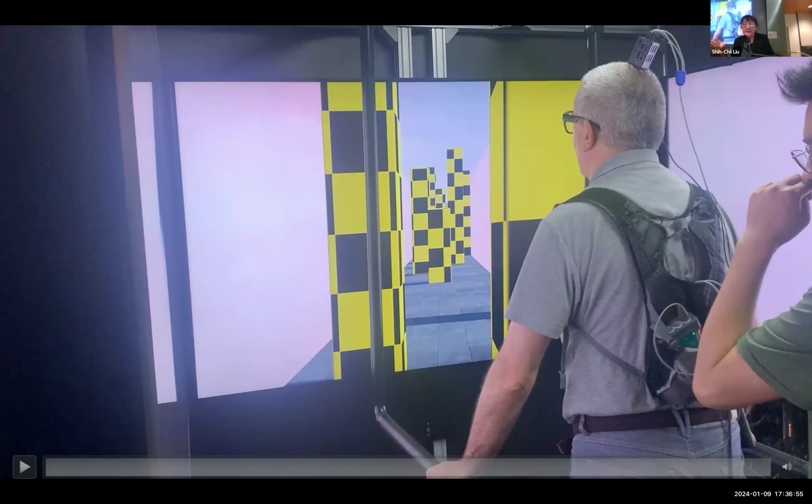At this UMH Institute, they also have a virtual reality room. What you see here is the screen, showing obstacles, and the person is holding on to these bars. When they walk, the floor moves, so they have a sense of how the person is walking, and then they change the picture accordingly. Here the subject is trying to play a game where he has to avoid hitting these obstacles and walk down to the end of the corridor.